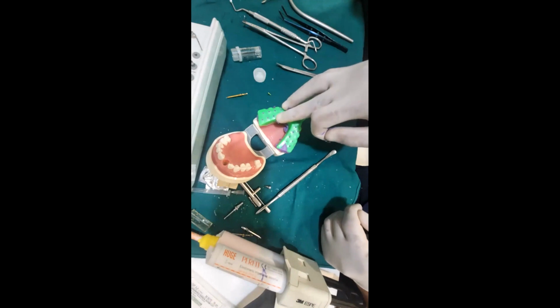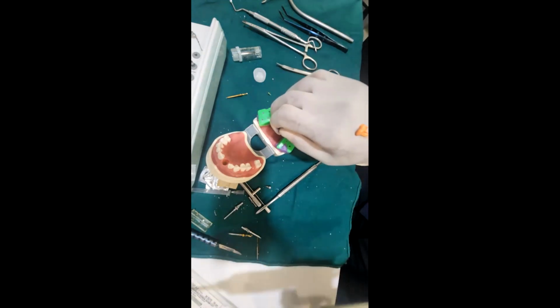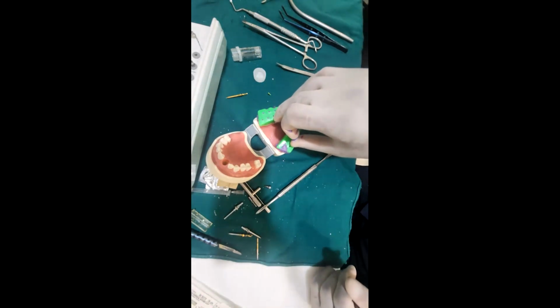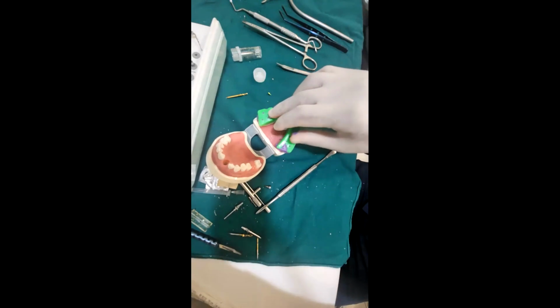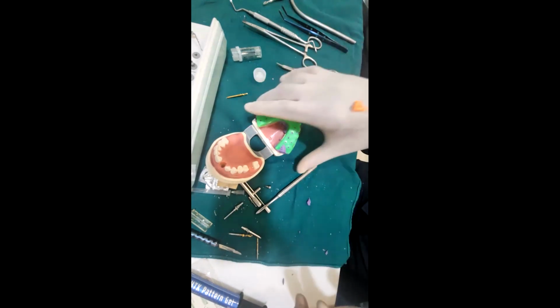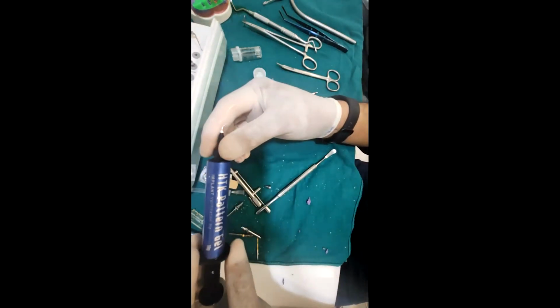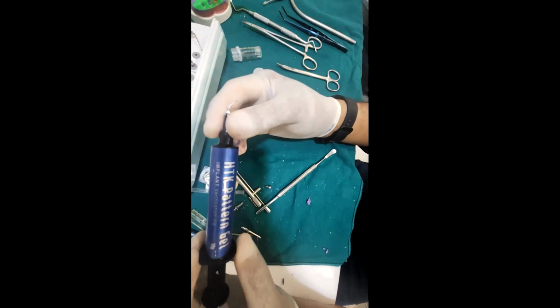You have to allow it to set well. Always take a little bit of light body on your glove hand to ensure that you don't remove the tray before it has set. Meanwhile, this is my pattern resin. As I had said, it comes in a light cure flowable form.